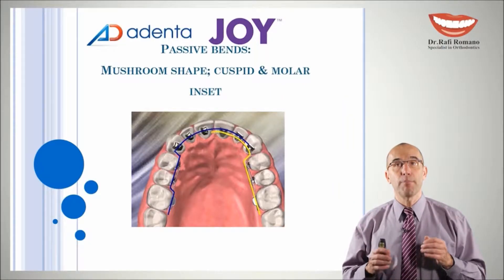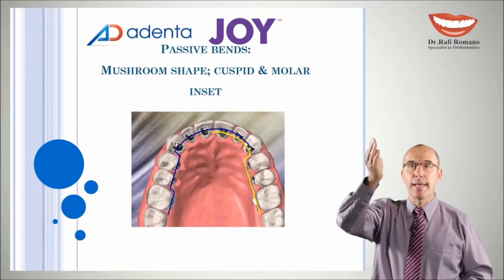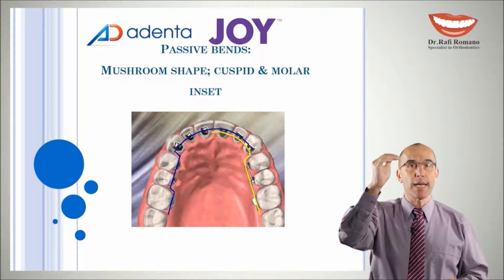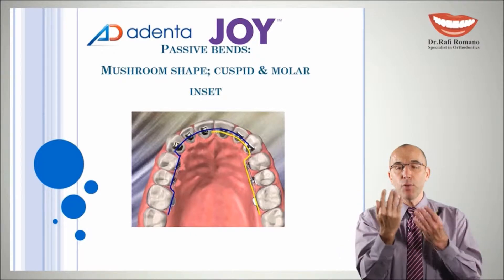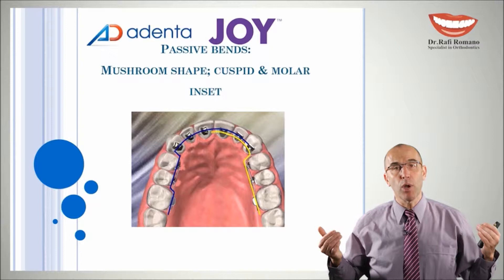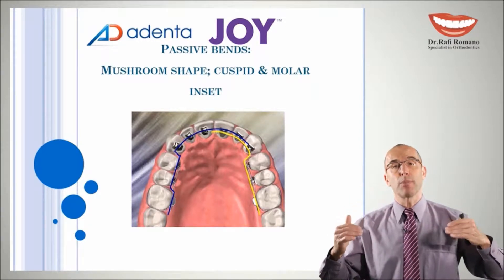The first bend is the passive bend, which we usually call the mushroom arch form bend, because the arch wire looks like a mushroom. We can place this bend more close to the cuspid if you have spaces, or more close to the premolar if you have crowding, because crowding needs as much wire as possible. In spaces we will get extra wire when we close the spaces, so we place this bend as close as possible to the cuspid.